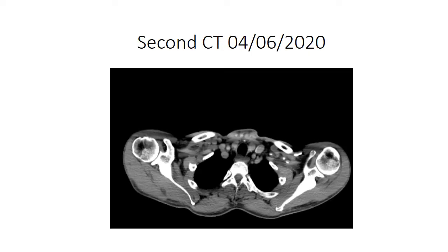This is the second CT after radiotherapy, almost after 6 months. Compared to previous scan dated December 12, 2019, there is mild improvement, however significant changes are not seen.